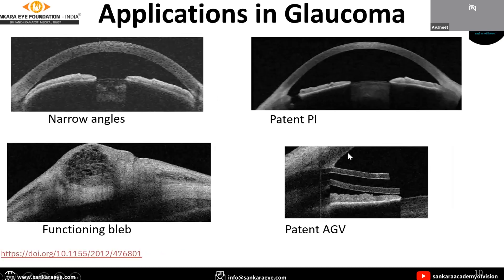Coming to applications in glaucoma, we can appreciate the narrow angles. We can see a patent peripheral iridotomy, a functional bleb can be seen, and the patency of the Ahmed glaucoma valve can be seen in this image.